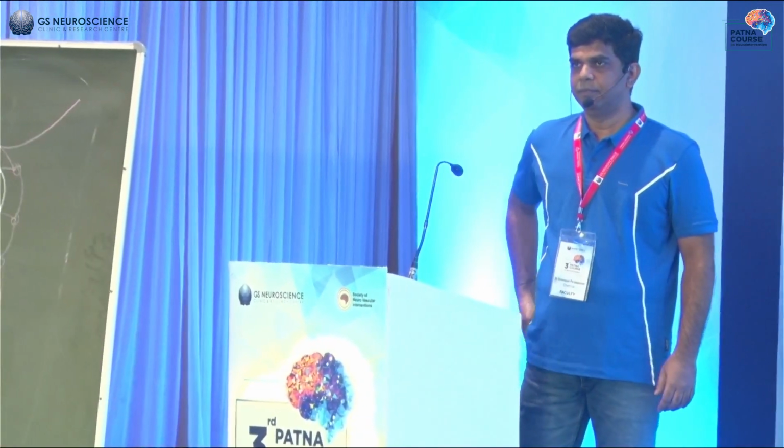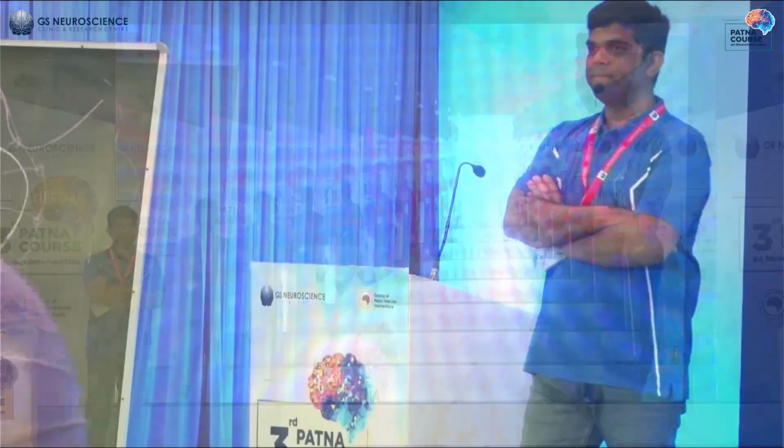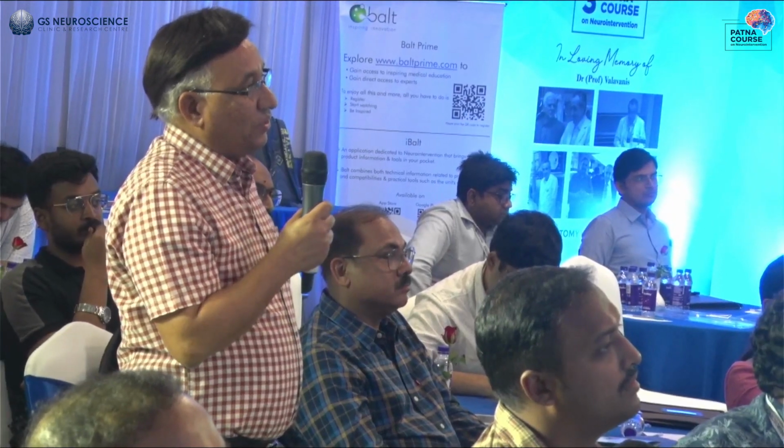Sometimes it's not feasible to go near the fistula and you have to be proximal. Then how do you get penetration of the glue up to the fistula? Because this is at least challenging for me. It's difficult to go to the fistula, you are proximal, you inject the glue refluxing rather than going antegrade. So how to... Correct, sir.